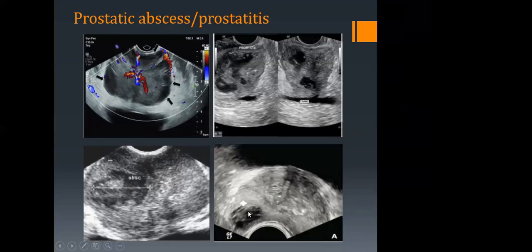And you know this is the posterior part of it. You see the urinary bladder there. Or you can have this. Okay? This is now the posterior part. And this is the bladder, meaning this is the anterior part of it. Image orientation. But what we are interested in is to show the pathology and clearly describe the pathology and where it is located. Like you can see, this is located in the peripheral zone, which is predominantly posterior.